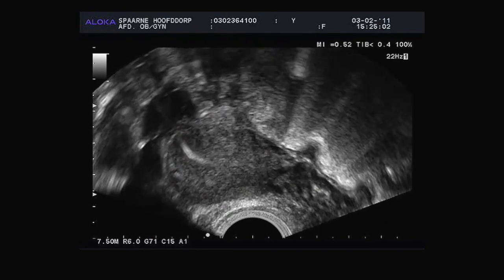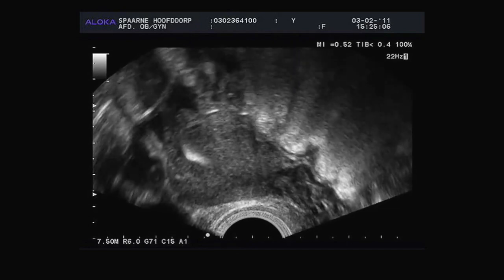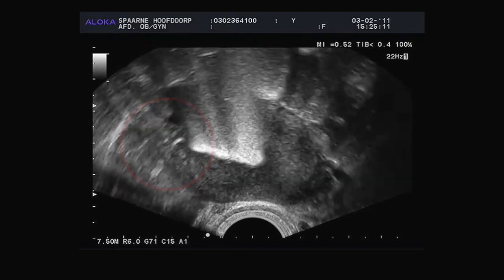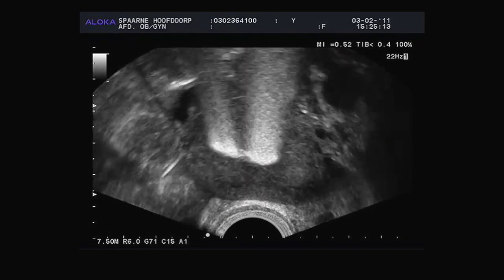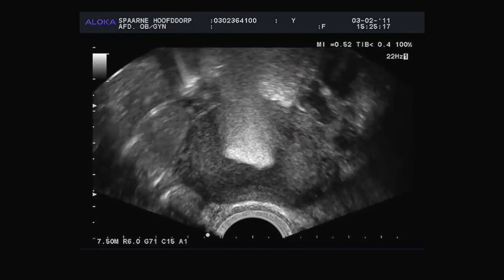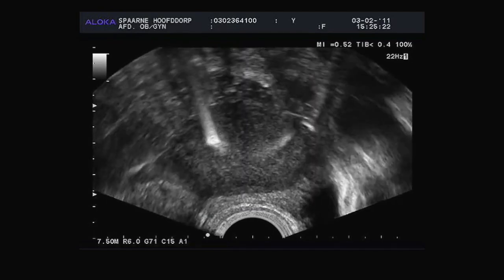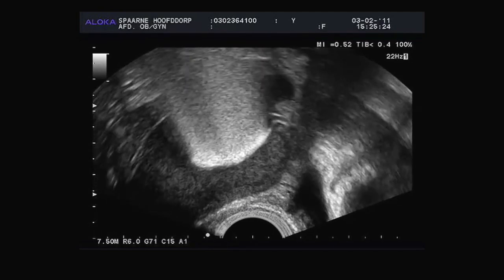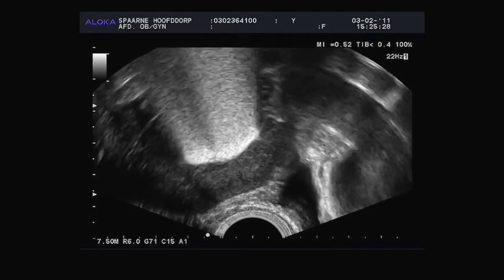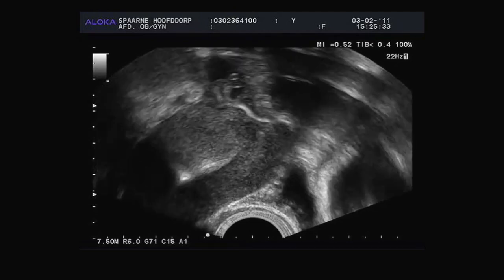The foam fills up to the fundus, and now we move a little bit to the side and from longitudinal to transversal, and then you can see the first fallopian tube come up immediately. There's a great deal of peristalsis, a lot of movement around it, which can sometimes make the ultrasound difficult. The fallopian tube turns with a sharp twist and then back again, turns straight as it comes back from the womb to continue behind the womb. This is behind the womb.